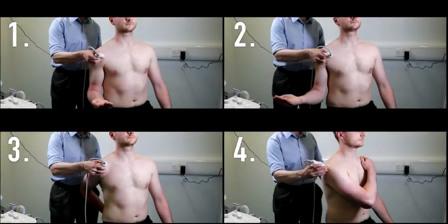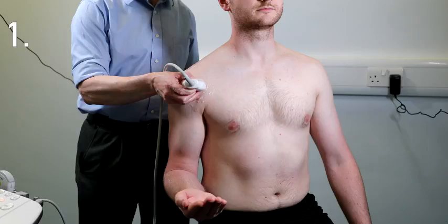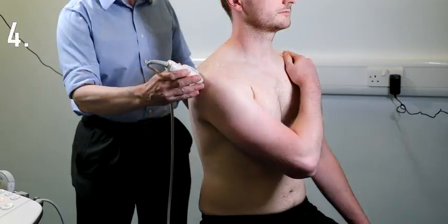The next step is to correctly position the patient. We recommend 4 key positions. Position 1, the patient sits with their elbow tucked into their hip and bent at 90 degrees. Position 2, the patient rotates their arm, moving only their hand out to the side. Position 3, the patient moves their hand around their back towards their contralateral back pocket. Position 4, the patient brings their hand forwards to touch their contralateral shoulder.